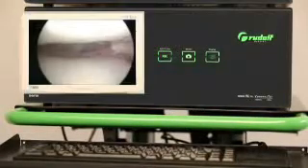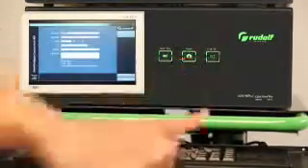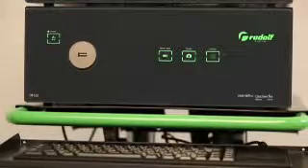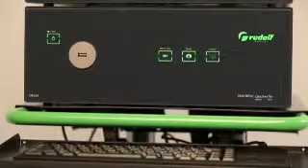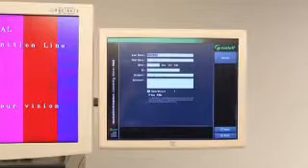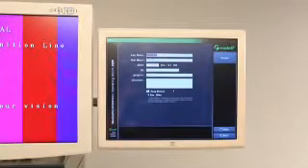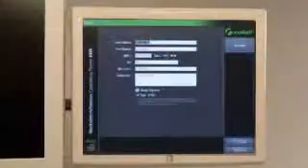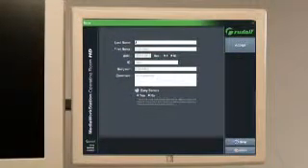In this case, by actuating the display key, the main monitor switches to the preview image of the documentation system, and the entire workflow from the input of the patient data to the data export can be processed via the main monitor. In this instruction, we're using a touchscreen monitor that's available as a design variant, which allows controlling the system by touch either from the unsterile area or directly from the sterile field by using a sterile cover. In the latter case, the documentation system can be controlled by the sterile operating theatre staff or the surgeon him or herself.